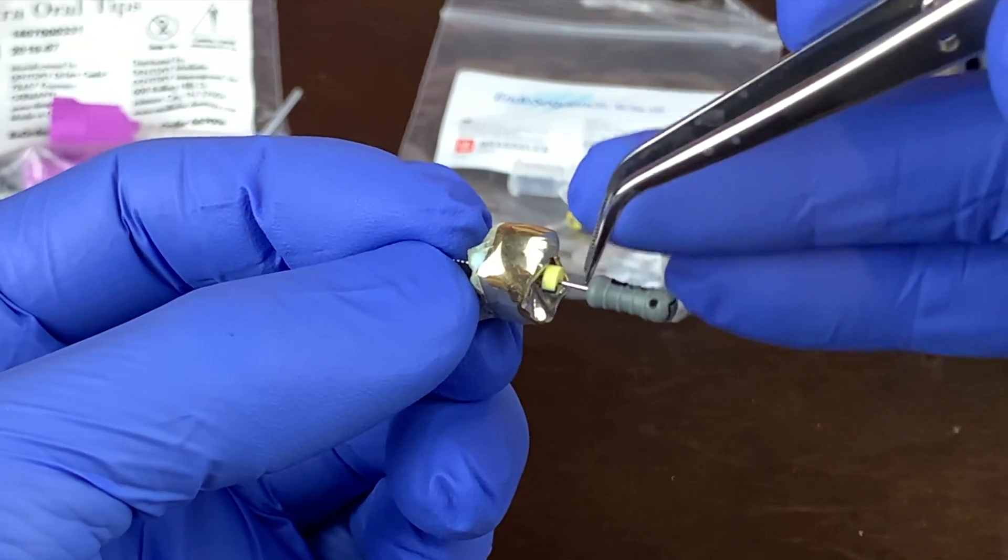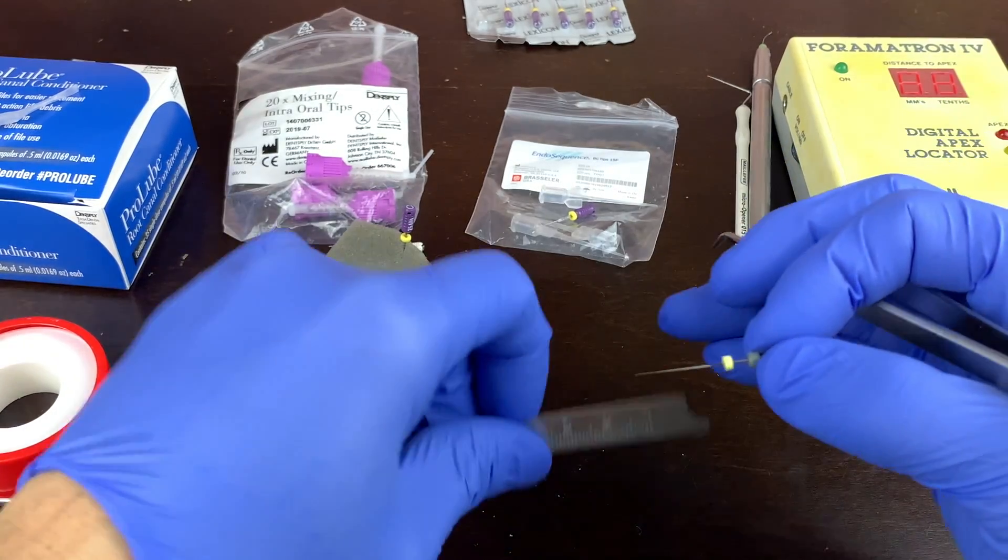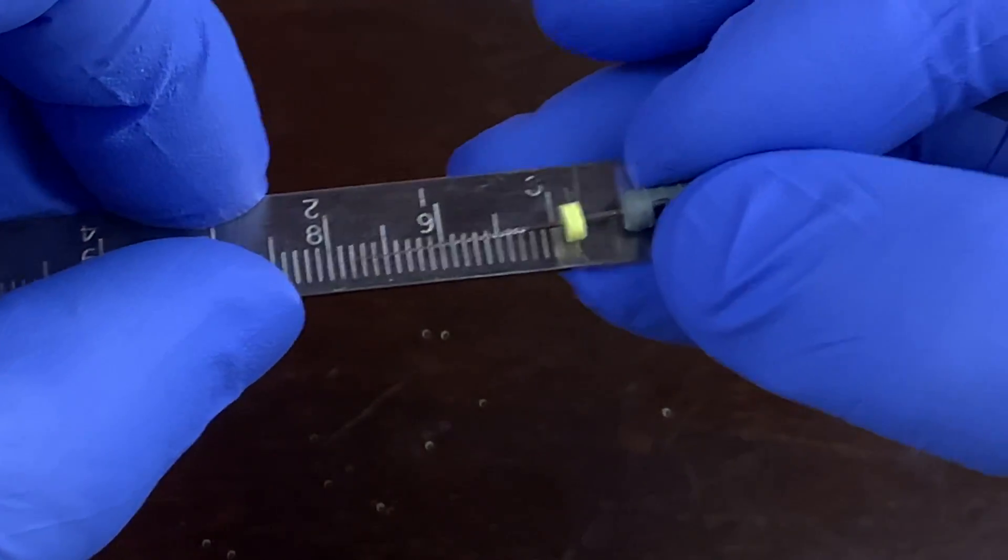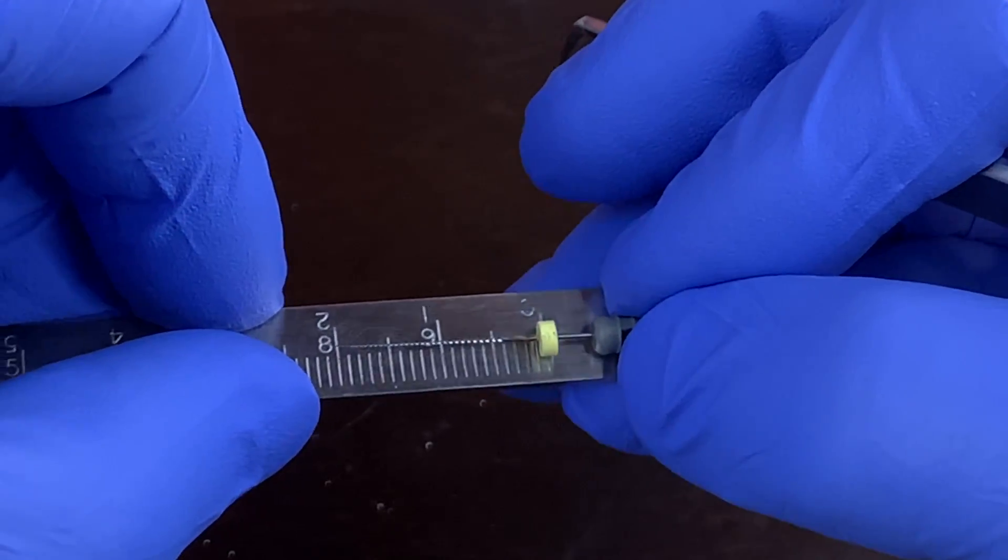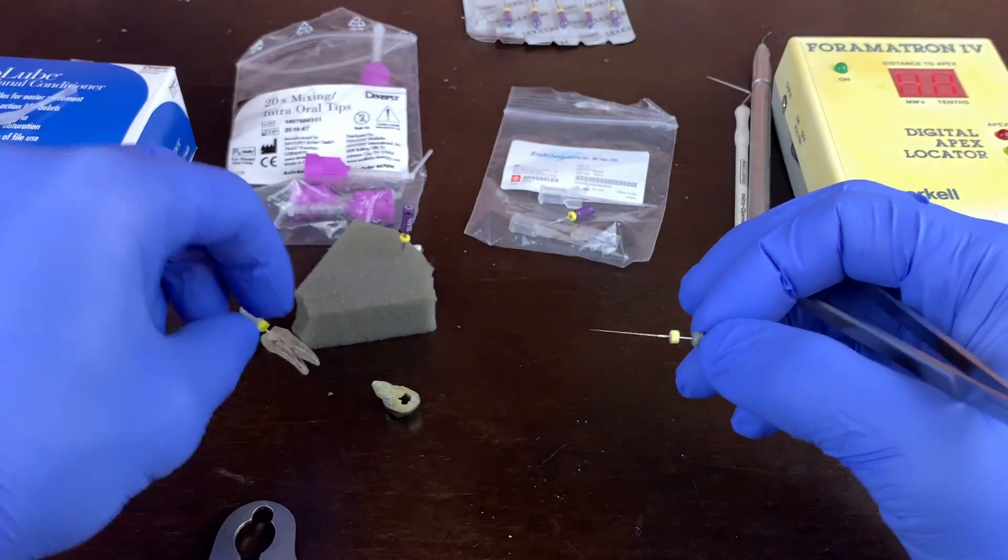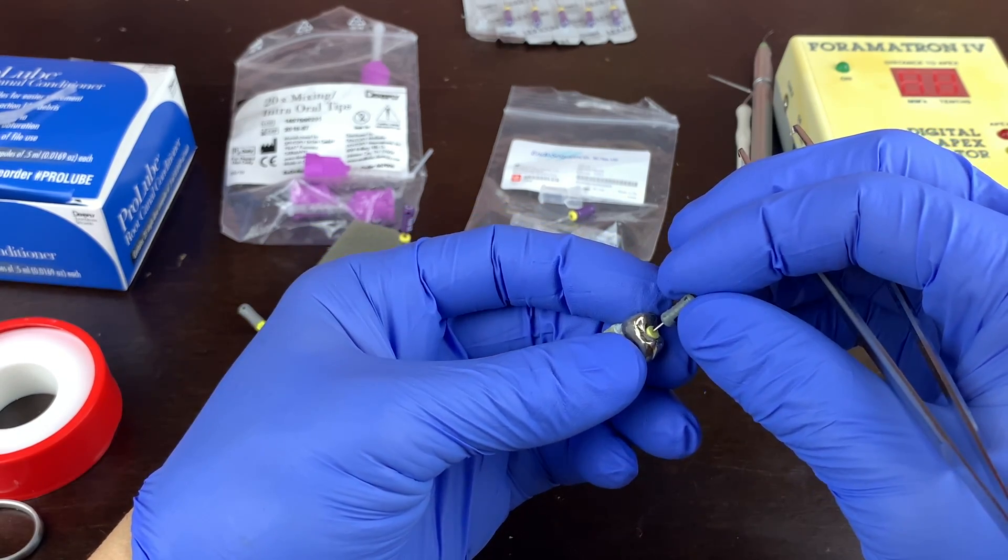So we'll see if it goes in there. I'm going to place my rubber stop lower. I'm going to take my measurement there. And then on my measurement tool, instead of measuring from the bottom of the rubber stop, what I'm going to do is measure from the top. So that's one way. And what that does is it helps the file to stay centered and not touch the metal.